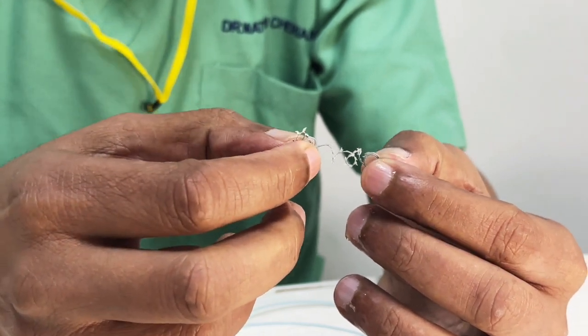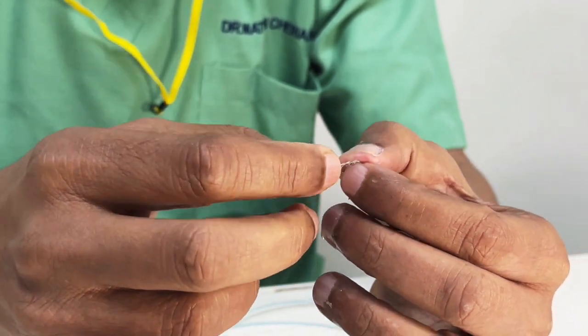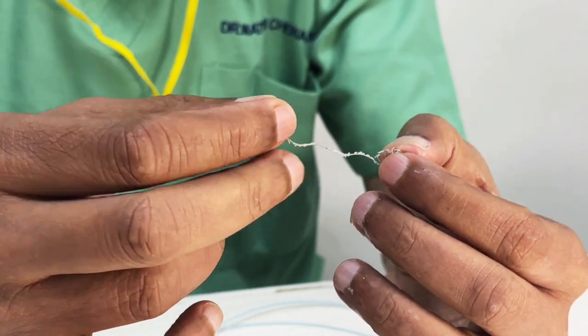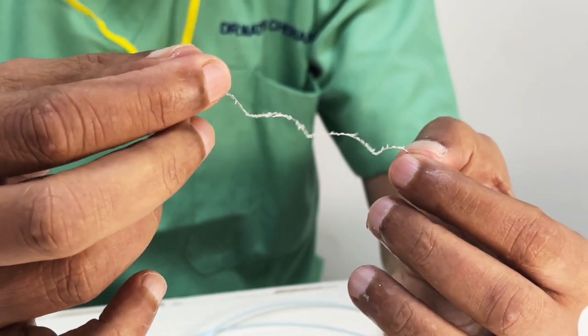Like I said, the safer play, if you want to use it, you can try it for a CCF, where you go on the venous side. Maybe an extradural IC aneurysm, but I have never done that. Much safer, but biggest disadvantage in all of them there is that it is not a controlled detachment, right?